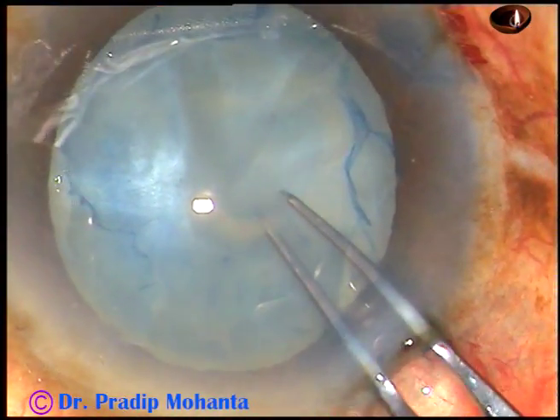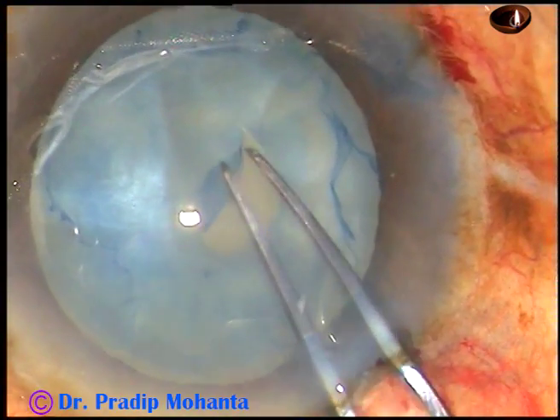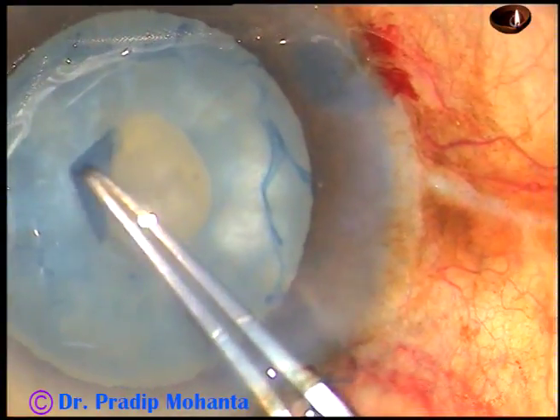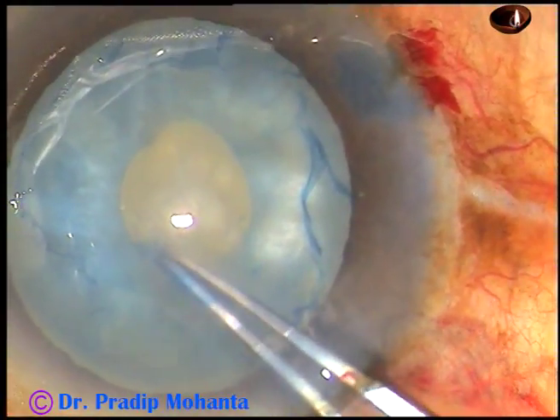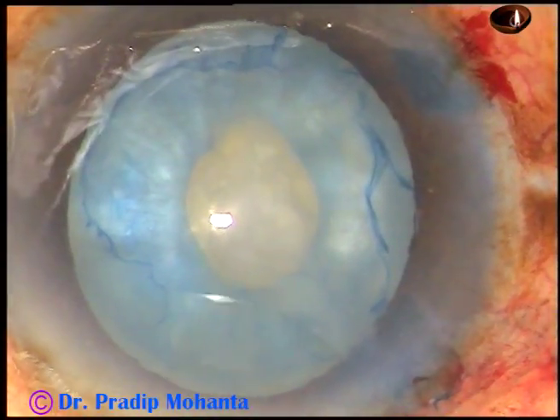I hold this flap and do a small rhexis. Inferiorly, it tends to go to the periphery. But since this is a very small rhexis, I can control it, bring it back, and complete a small rhexis. I call it a mini-rhexis.